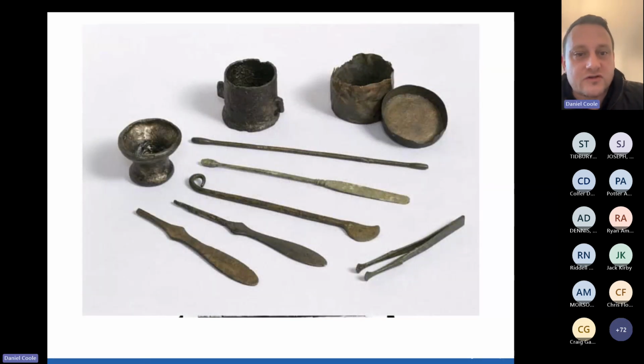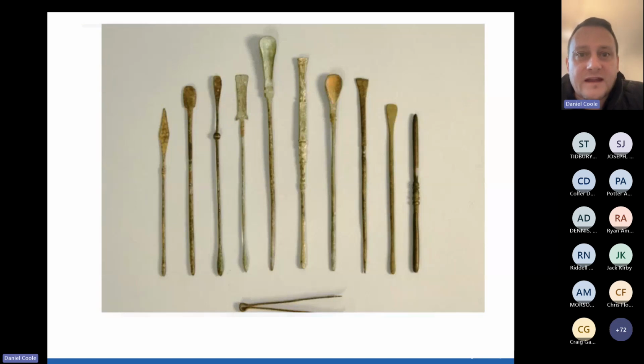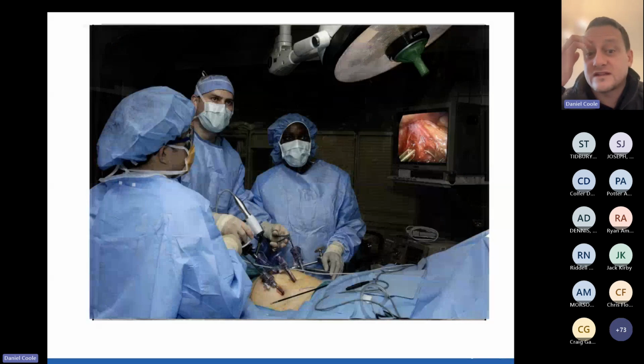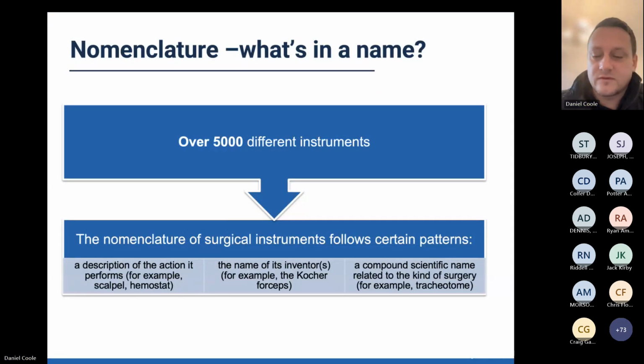Just some slides showing instruments across the ages. Obviously, there's been evidence of instruments through Egyptian times, Roman times, and how instruments have been designed from different materials, and then coming through to the modern day. Obviously, over 100 years ago, the introduction of stainless steel, which is widely used in surgical instruments. Of course, now we have laparoscopic surgery, which is widely used, and indeed also robotic surgery now. However, a lot of these instruments are, again, more or less the same devices as the instruments that have been used for, in some cases, 100 years, just of a longer length because of the nature of how they're used in laparoscopic surgery or robotic surgery.